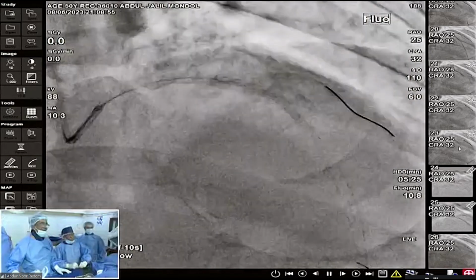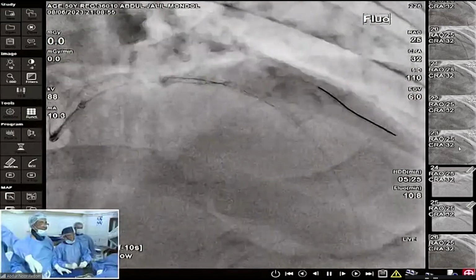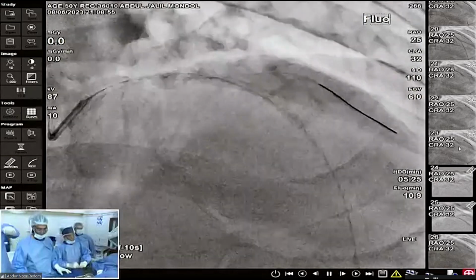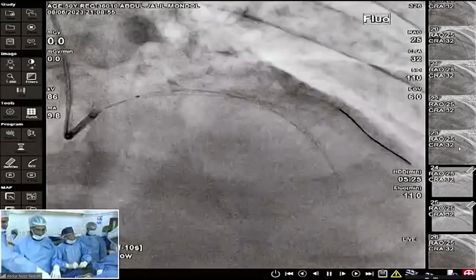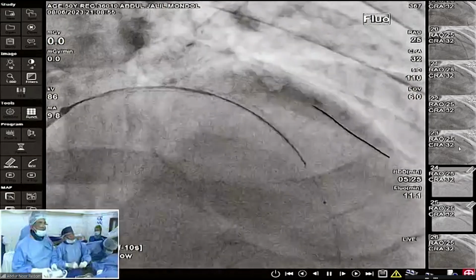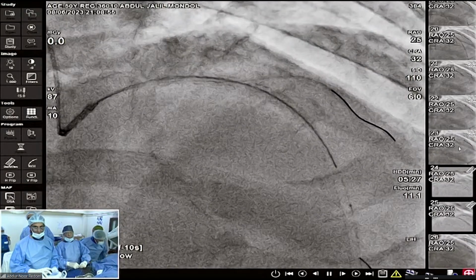Even though I'm from America, we still believe in cost effectiveness, so if need be, then we'll do one more dilatation. Yes, that is very much important, especially from our perspective. Cost is a big issue. We have crossed the balloon.